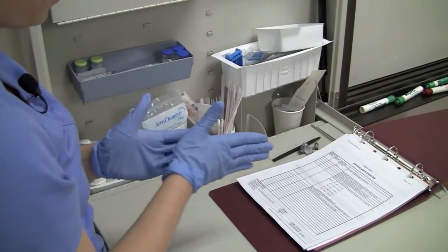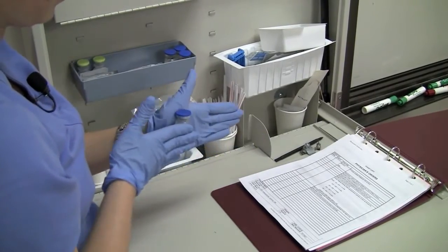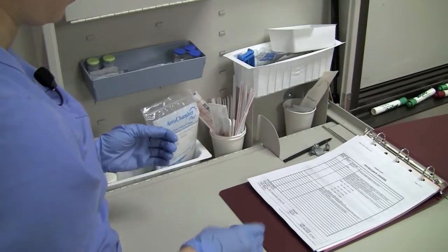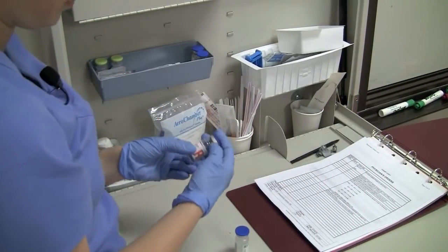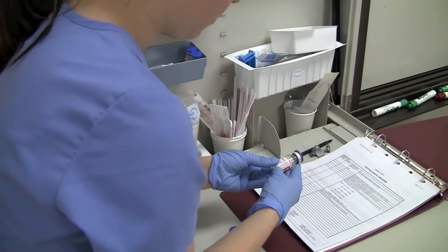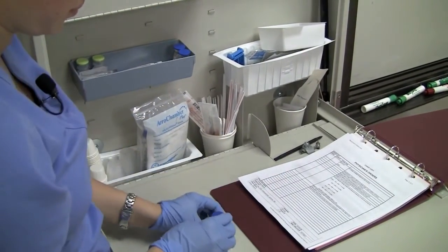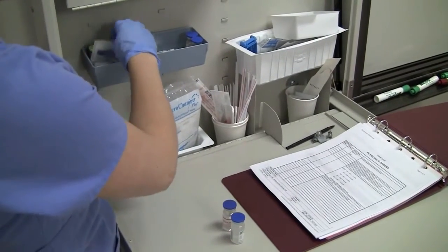Mix the solution by rolling the vial gently between your hands. When mixing insulin, always withdraw the regular insulin — which is clear — first, to minimize the possibility of the regular insulin becoming contaminated with the additional protein in NPH, which is cloudy. Remember: clear before cloudy.